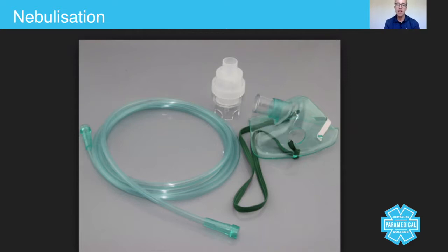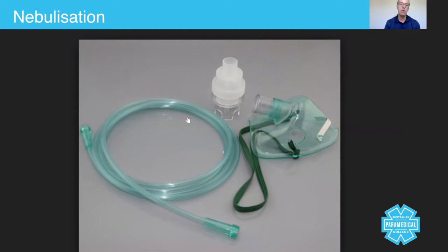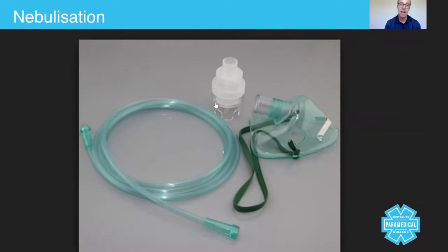Nebulization involves using a mask, oxygen tubing, and a device called an acorn to house a certain drug. The drug is placed into here — you screw the top off and place the drug, usually salbutamol, into here.